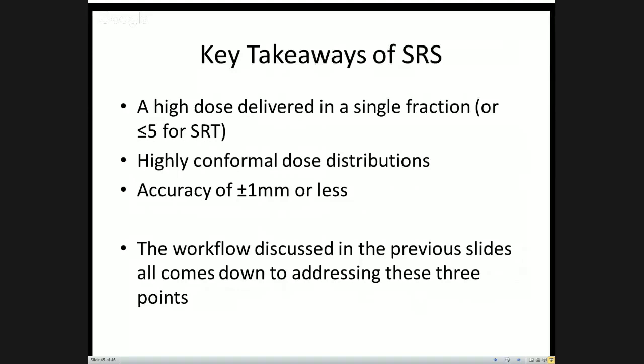As far as shooting each field separately for MapCHECK, I'm not as familiar. As I mentioned before, we shoot individually and analyze them field by field, but we also want to make sure that the sum of all those fields and the total dose is in good agreement.